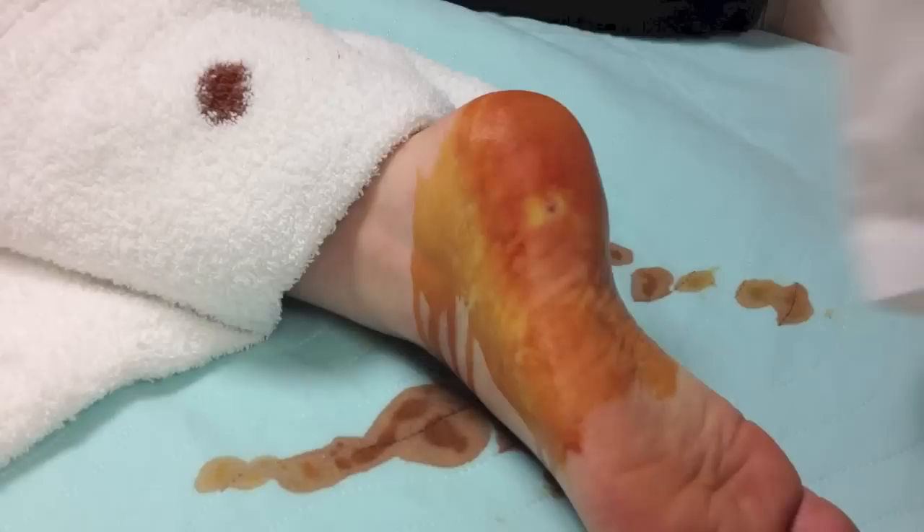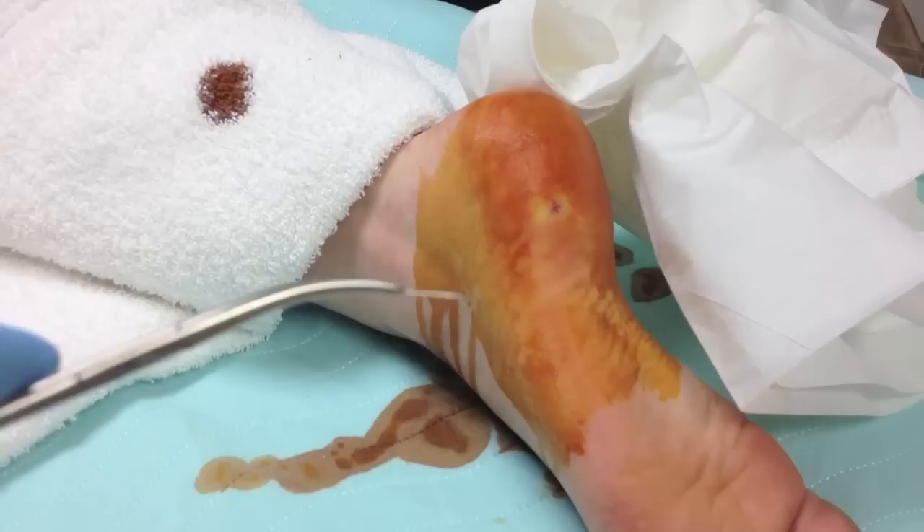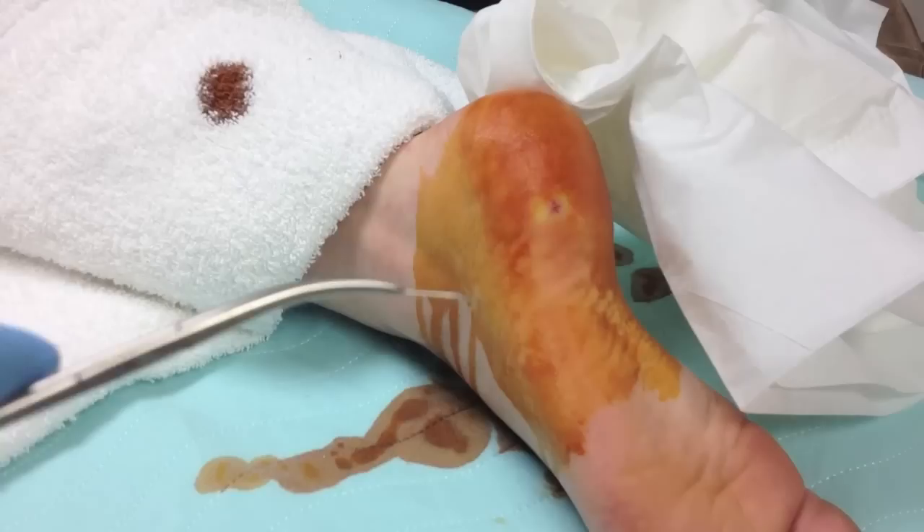There's still nothing to repair. We thought there were two pieces in there. That was a small needle — a regular shot needle. The important points about this is to try to get the foreign body out while doing the least trauma to the underlying tissue. I was going really slow trying to minimize the amount of scarring. Of course it would have been easier to make one big cut, open it up, and get it out, but I was being very careful and detailed to do the least amount of cutting so that the tissue would expose the foreign body and we could grab it.